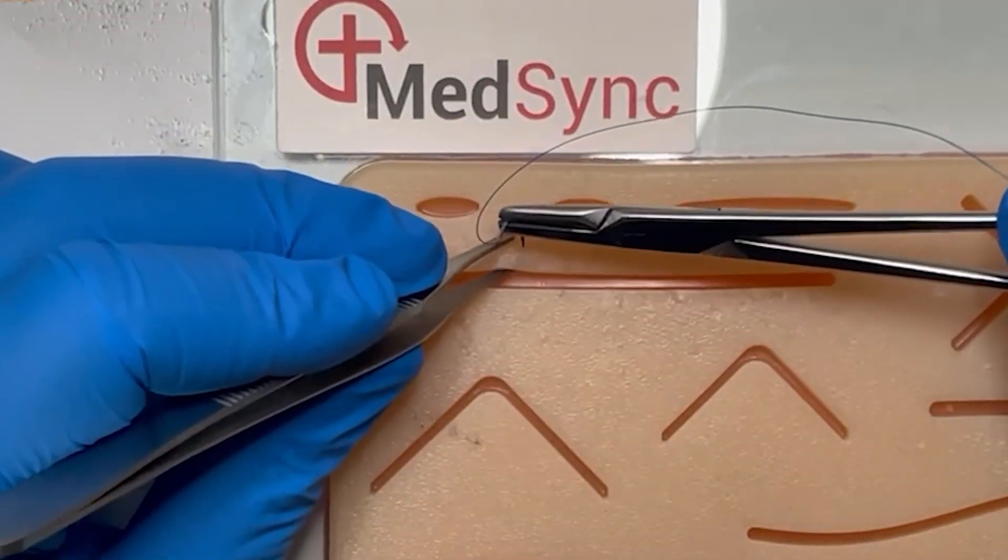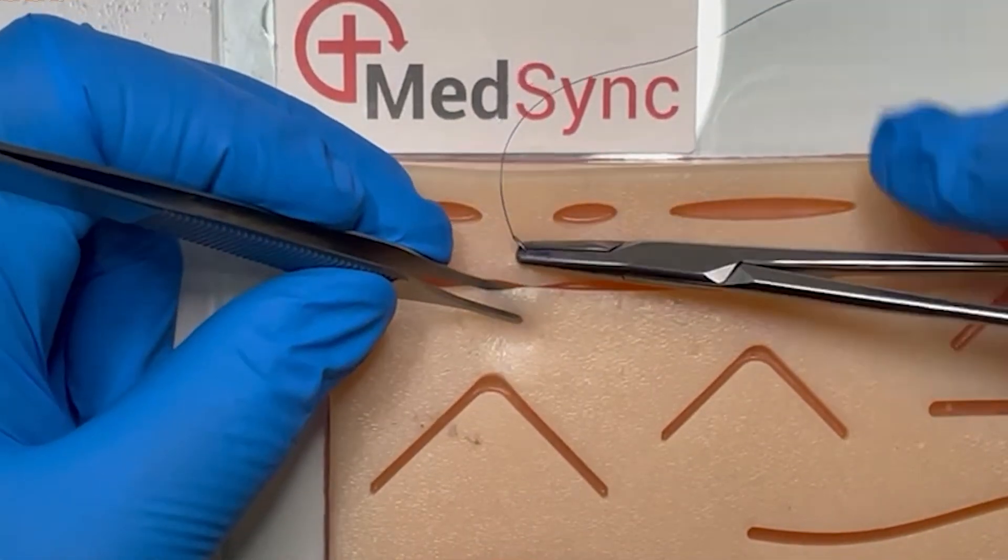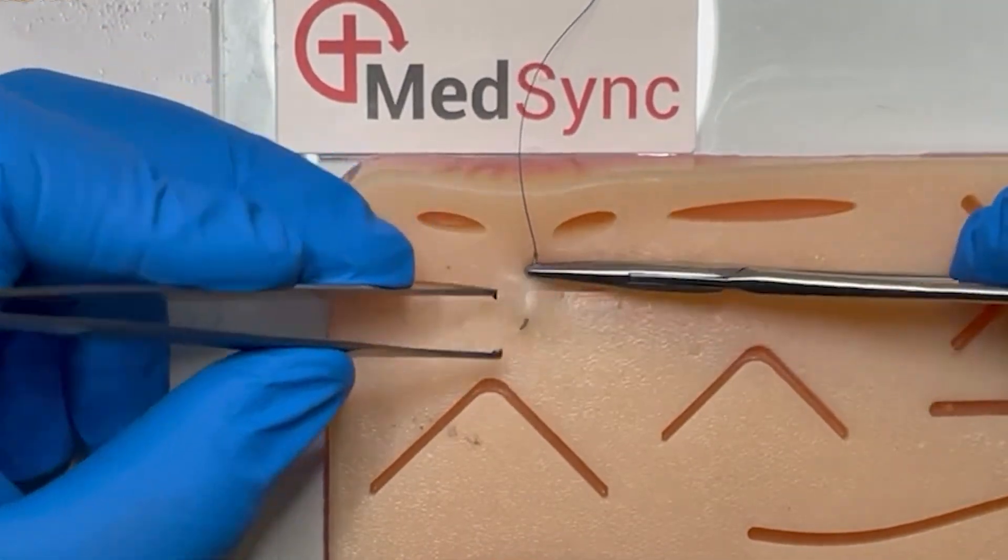In the first technique, with the needle two-thirds through the skin, you can retrieve it with your forcep, ensuring to follow its curve.